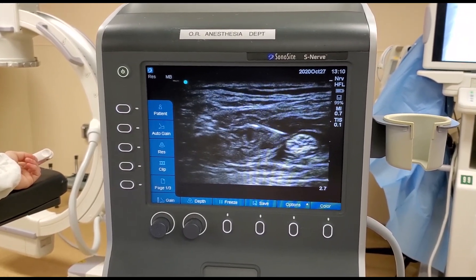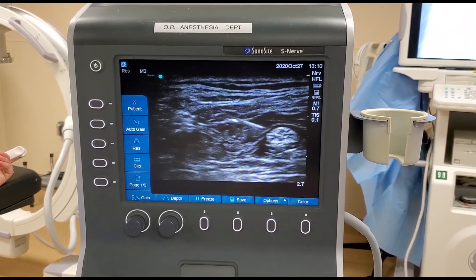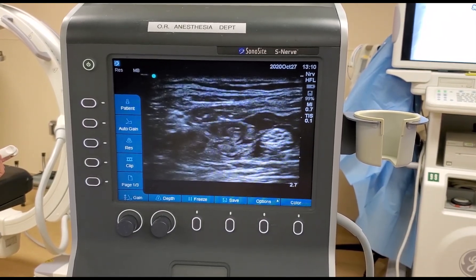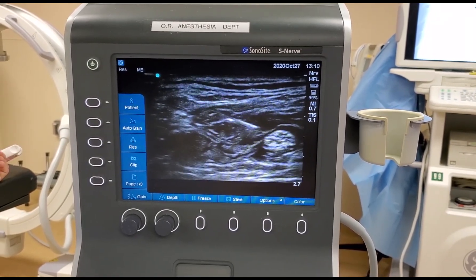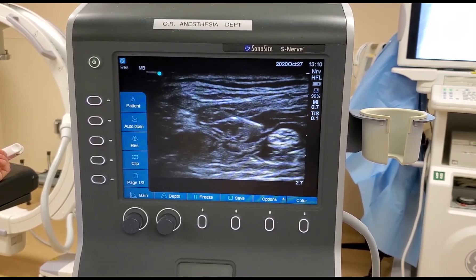Always visualize the tip of your needle. Now this block will cover most of the lower part of the leg except for the medial aspect, which is why we need to supplement it with the saphenous nerve block, which will be next.